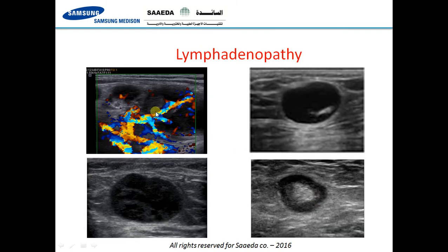Here are different kinds of lymph nodes — you can see the fatty hilum, slightly reduced. By Doppler exam, they show a benign appearance.